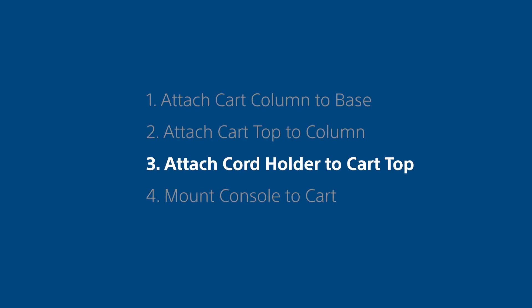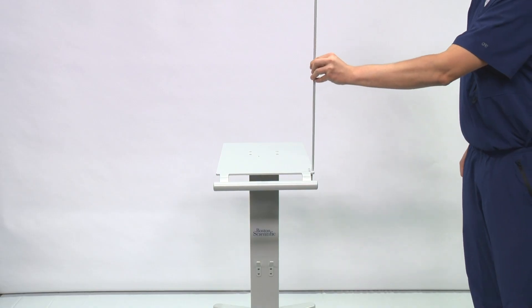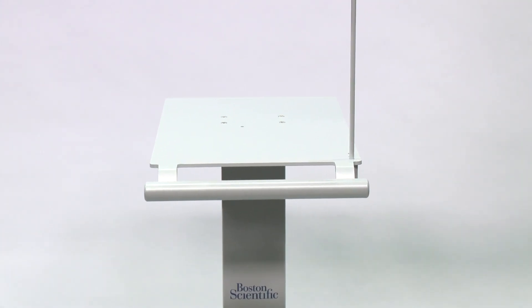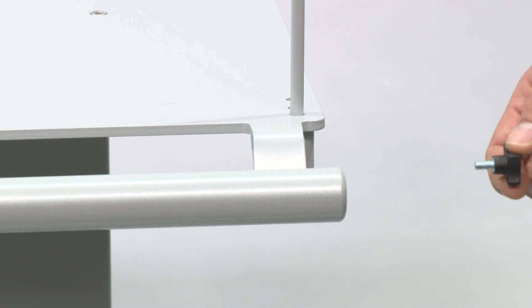Step 3: Attach the cord holder to the cart top. Place the cord holder in the opening at the front of the cart top. Attach the cord holder to the cart top using the thumb screw provided.